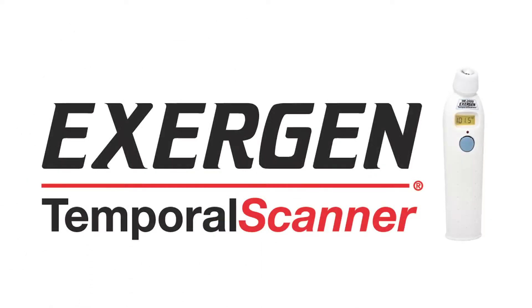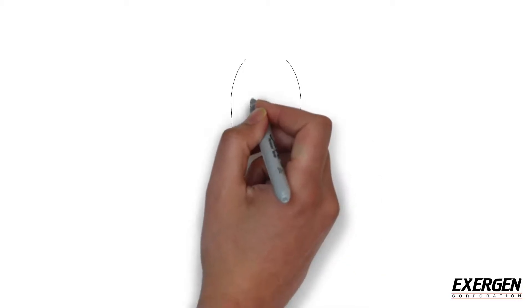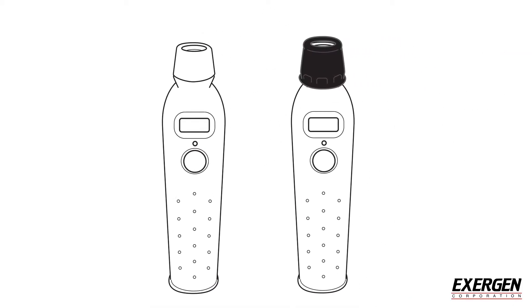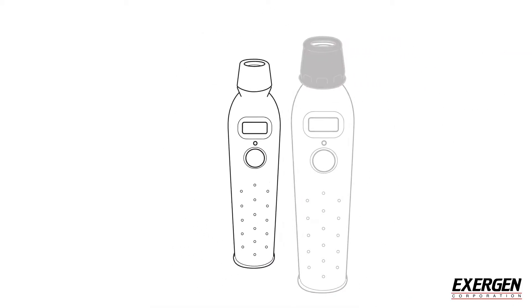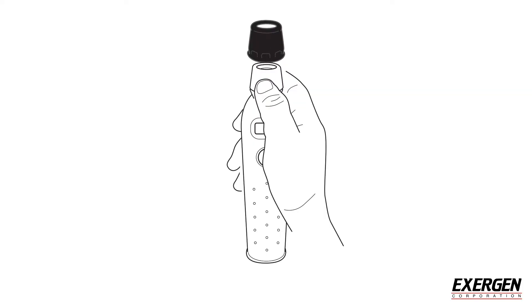Before using the Exergen Temporal Scanner, read the instruction manual completely. The Temporal Scanner TAT-2000 can be used either with disposable caps or without. The caps are easily applied onto the probe and after every use, ejected off with a gentle push of your thumb.